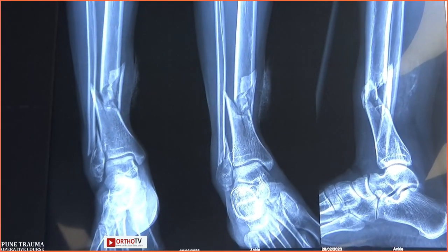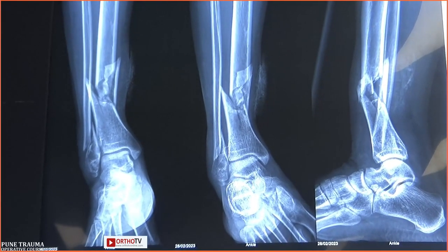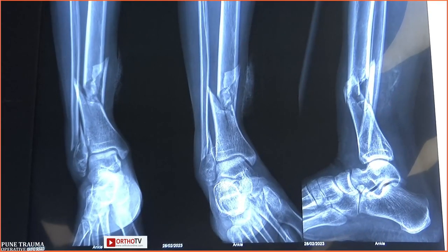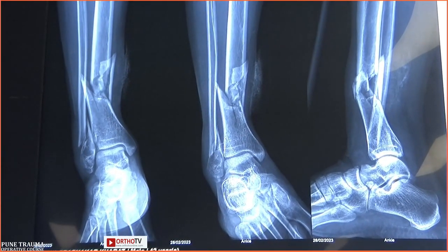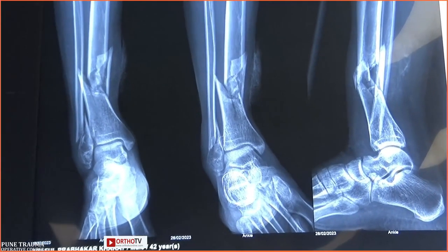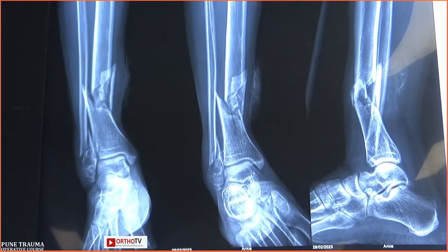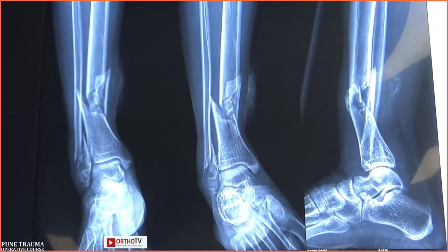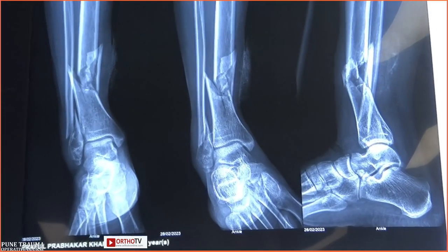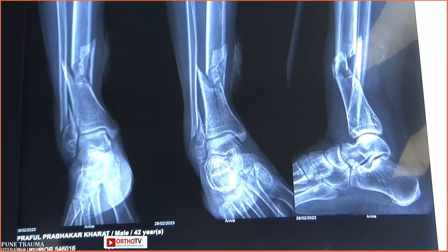Fibular fixation, yes, it's controversial whether to do the fibula first or second, but we have decided here to do it first. There is no controversy. Every book and every paper says that a fibula has to be fixed first. Yes. But my reason is sometimes we lose the fixation of the fibula during manipulation. So I normally put a guide wire in the tibia first, then fix the fibula. Yes, but that is more applicable in a distal third rather than at the level of the malleoli. Thank you, sir.